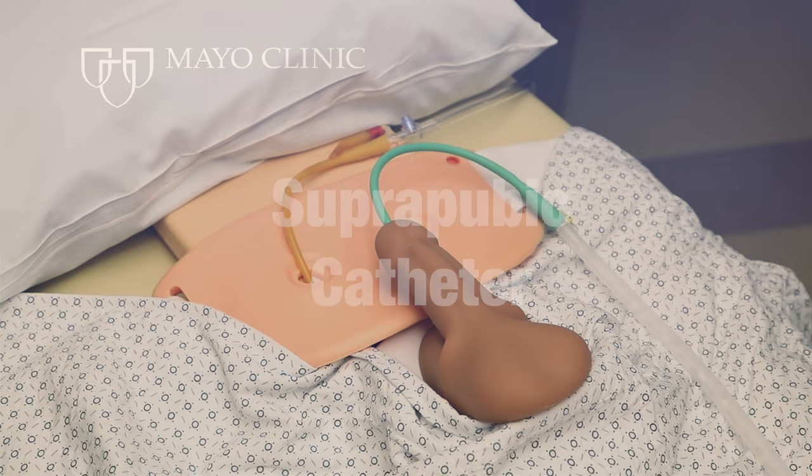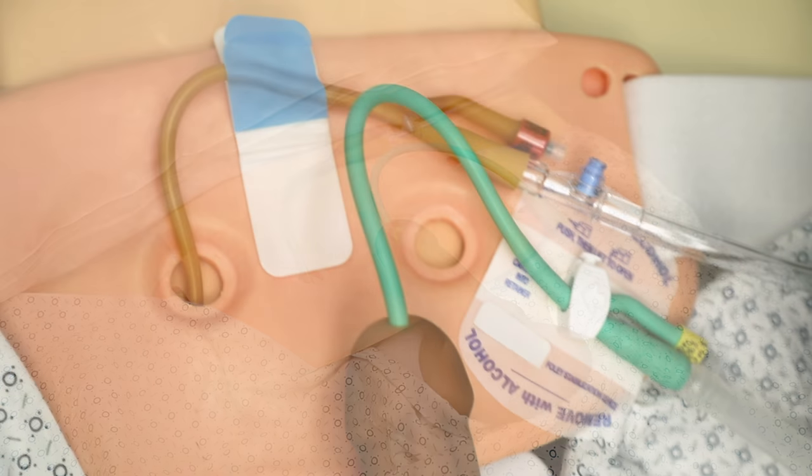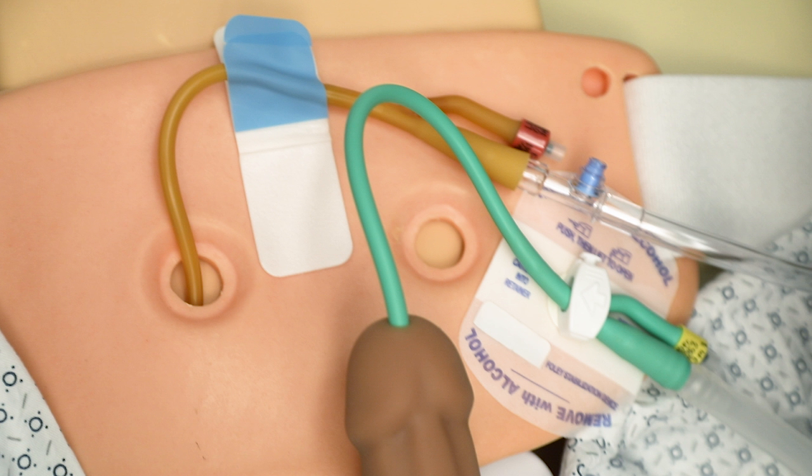The purpose of this video is to show how to anchor a catheter placed into the bladder. Proper anchoring of your catheter can reduce pain in the bladder and urethra caused from the catheter being pulled on or traction being placed on the catheter. Many anchoring devices are commercially available, and a few of them will be demonstrated in this video.